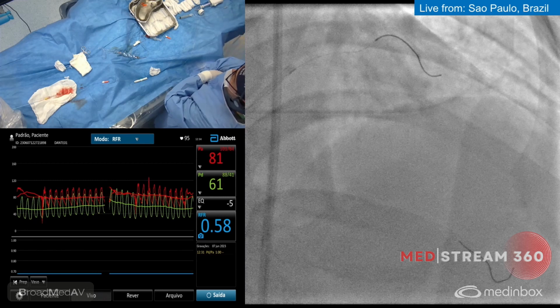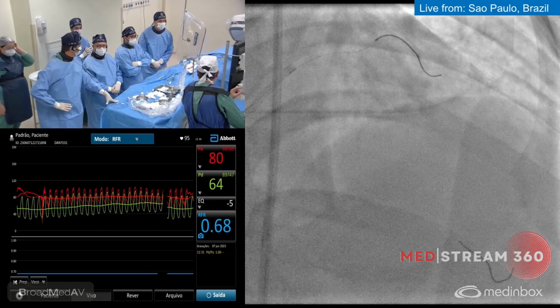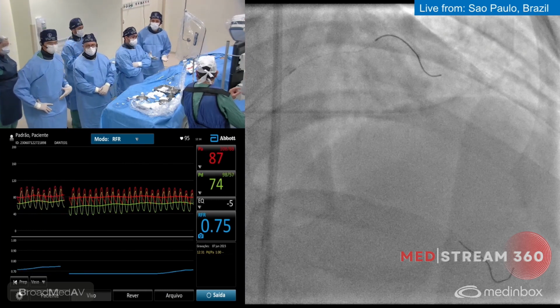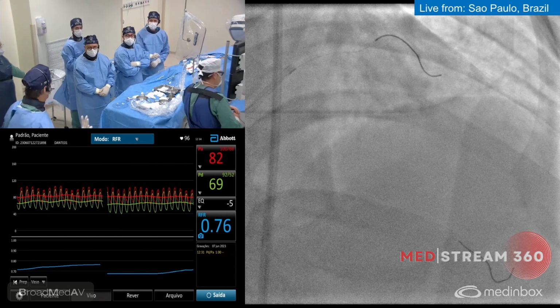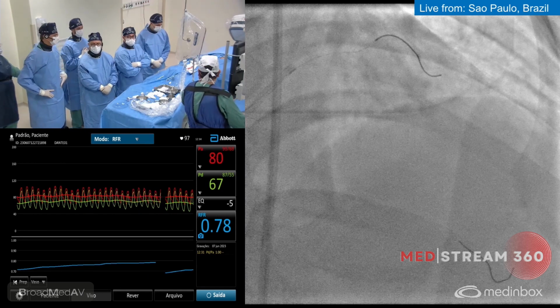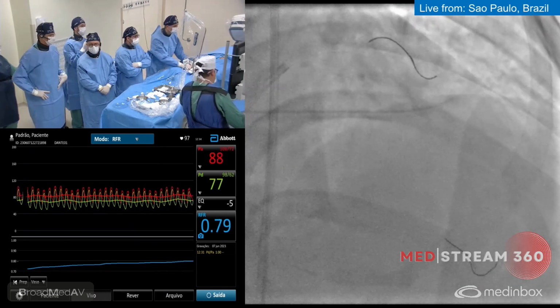Okay, so we just gave nitro. It's good to wait a little bit before we do the measure. Just wait a little bit because we just did the nitro. 30 seconds. So we are in a very distal position. We take all the myocardium at risk here in this anterior territory. Based on this ostial lesion, can you bring back the guide wire? Yeah, I think we can do it. Pull back. Yeah, I think the tip of the wire is a little bit distal. Then we would pull a little bit.